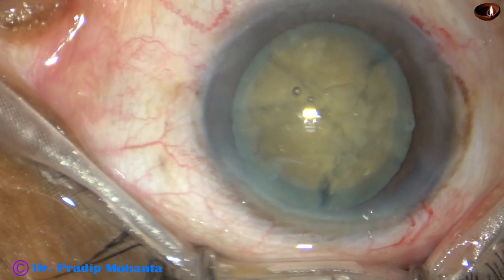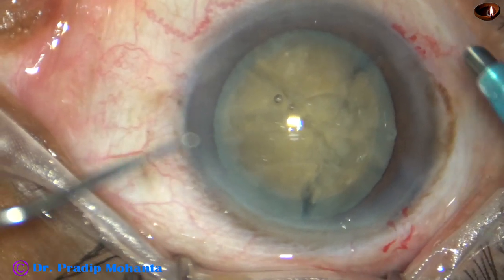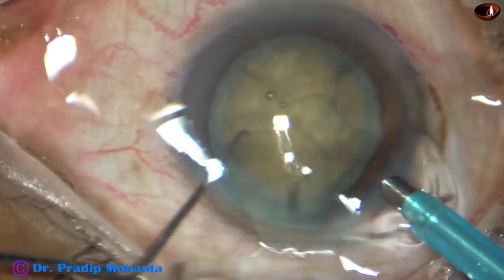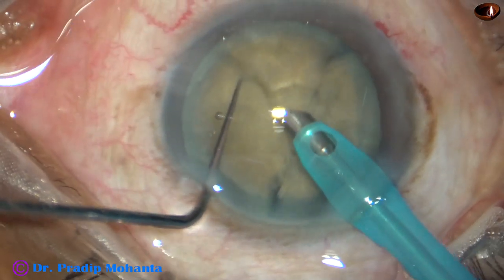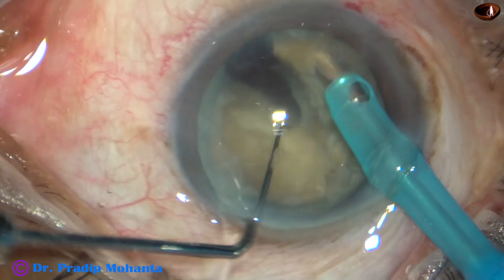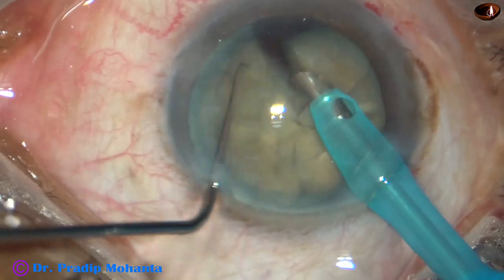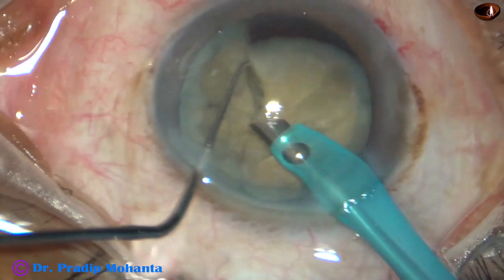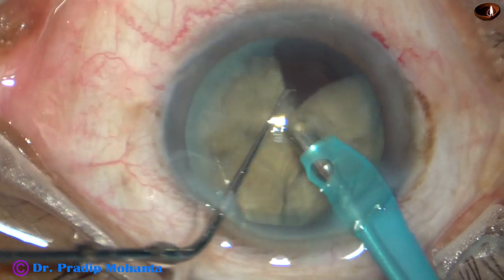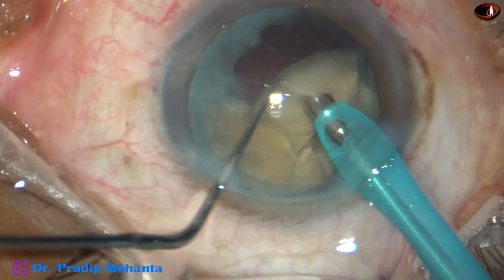I have to do this case somehow. My plan is to trim the peripheral portion of this hard nucleus. I try to separate it again but could not. Now I have started trimming the peripheral portion of this lens mass.